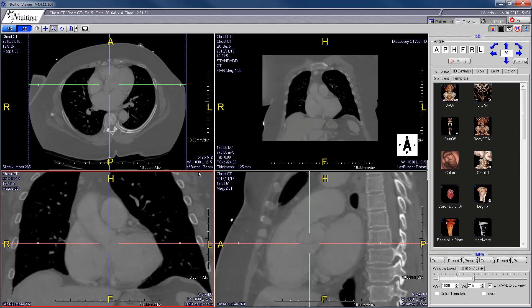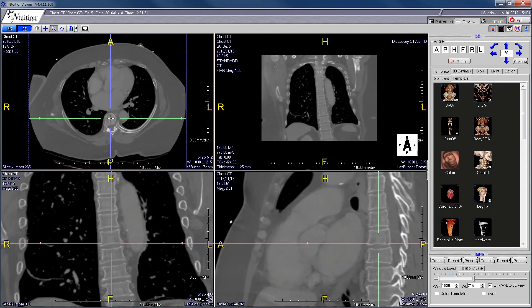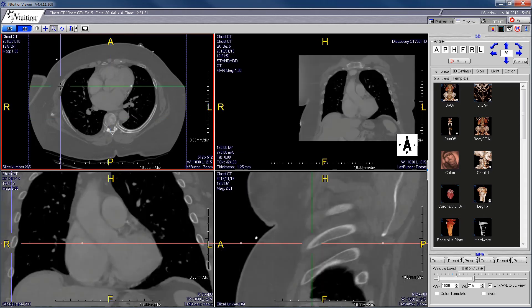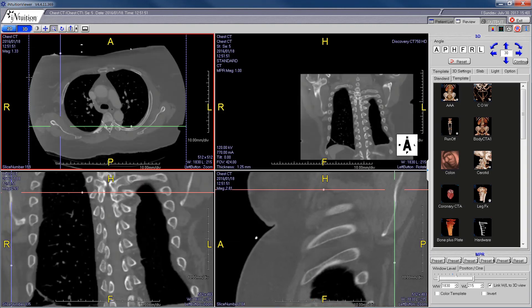A more efficient way of localizing something in all three planes is to hold down the ALT key and then left-click on the structure of interest. For example, clicking on the spine in the axial view will align it in the coronal and sagittal planes. You can also click on a rib, or go to the sagittal and click on the scapula, and it will realign in the other planes.